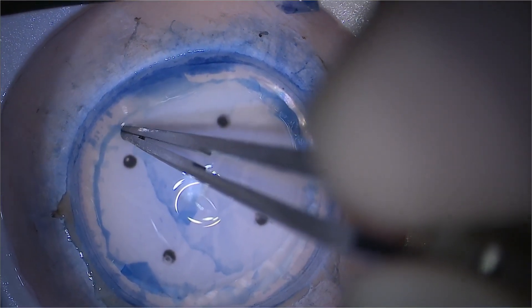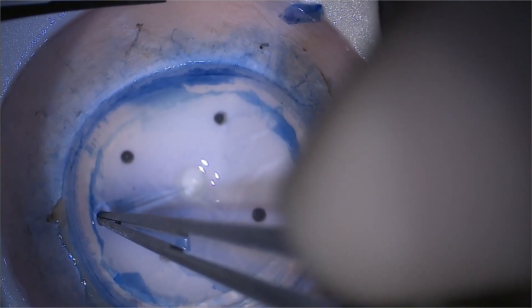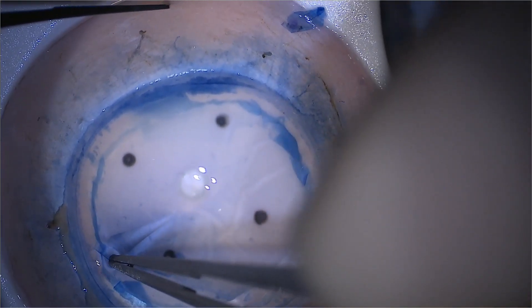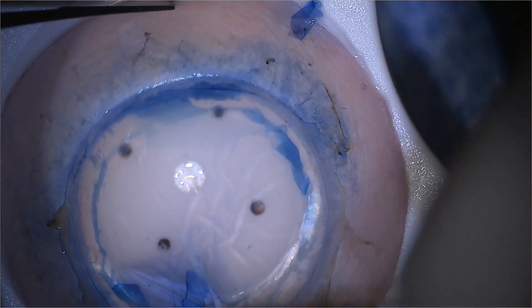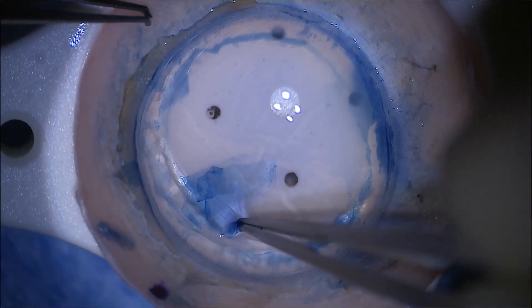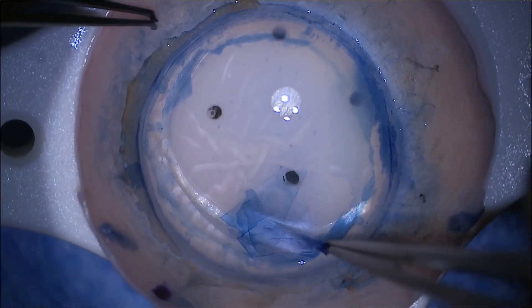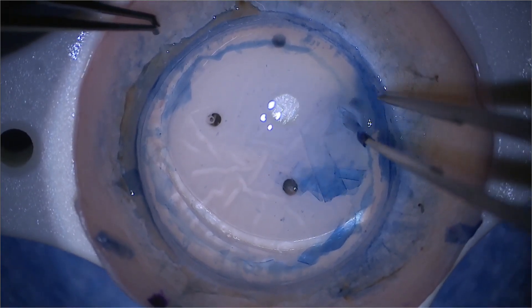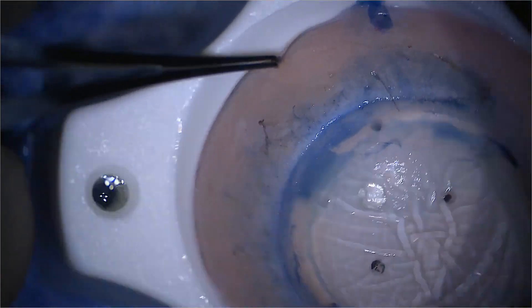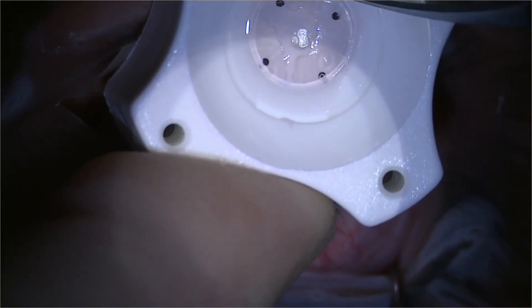Using a slightly modified technique just to peel it sideways. Now when you remove the central Descemet's membrane, because you're going to do a trepanation that may vary in size, it's worthwhile using a spear to remove the residual Descemet's membrane in the periphery, and give the stromal surface a little wipe to make sure there's no residual elements — you don't want any trapped areas. Now I'm doing the trepanation with an 8mm donor.